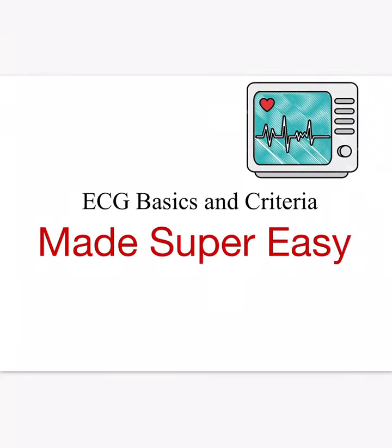Hello guys, in this video we'll be talking about the ECG. What are the basics that you need to know and how can you easily identify an ECG? I have included a sample of 20-30 ECGs that are most important to know. But before this, we'll discuss the basics that will help you identify the ECG.